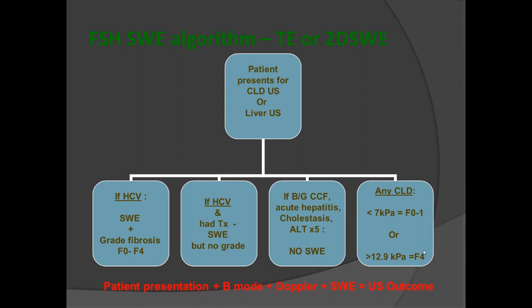So what's next in this space? Well, we know that at the most recent European College of Radiology meeting in 2017 in Vienna, there was presentation of this table for using the Toshiba 2D shear wave for any disease process. And we hope that that work gets published soon because it will enable us to use it in any disease process.